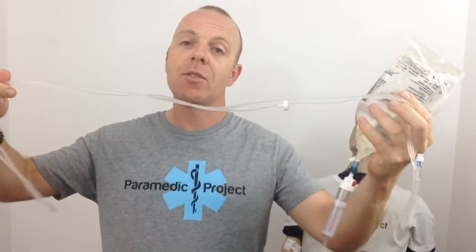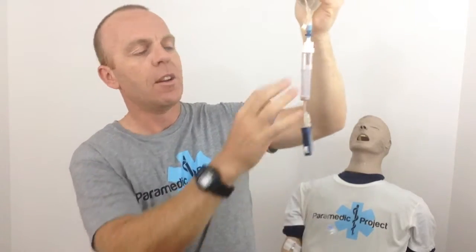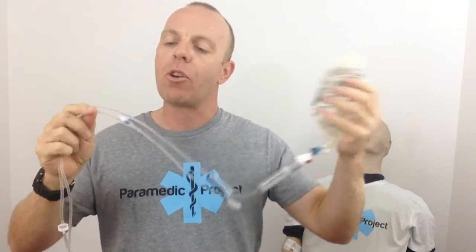First, we're going to have a detailed look at the actual equipment: the giving set and the fluid bag. The first big thing we need to understand with these giving sets is that when you look at them there are lots of nooks and crannies — the port, valves — different places where air bubbles can congregate, particularly if you forcefully prime these. If you squeeze the bag and forcefully push fluid through the giving set, you'll find a lot of air bubbles congregating in those nooks and crannies. So we need to pay particular attention to those places when checking it after priming to make sure there are no air bubbles.